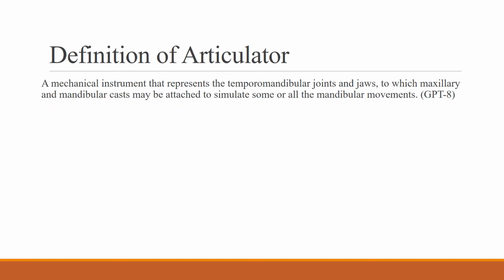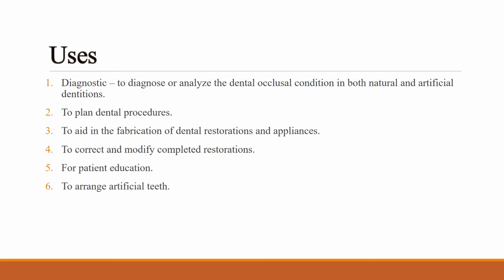So, just explaining the definition in an easier way. The articulator basically simulates the TMJ, right? You can just think about it like that. Not a face, but it's basically a joint which opens, closes, and does some lateral and protrusive movements.